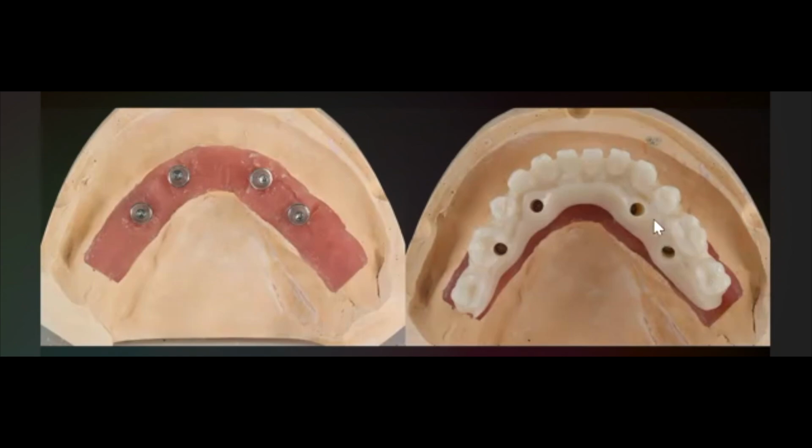So, you can imagine, if you have to design a big framework like this, a big amount of material, you have to be very careful, especially in a case like this, that it's a screw-retained case, and there are some holes, and these holes are weak areas that interrupt the material.